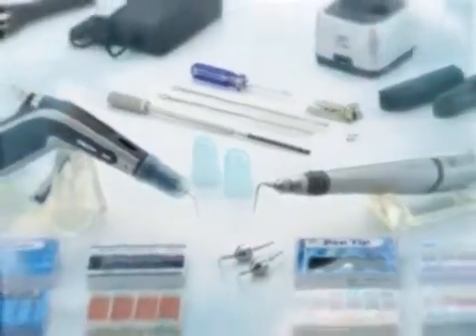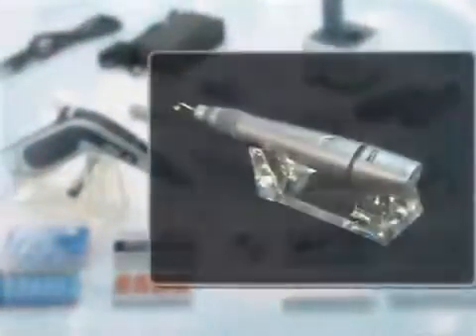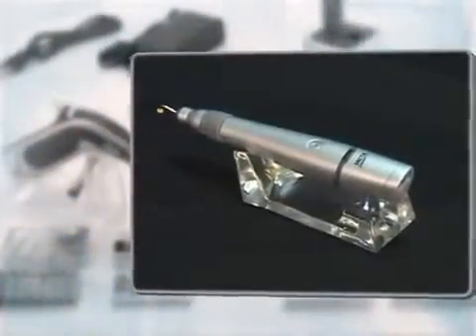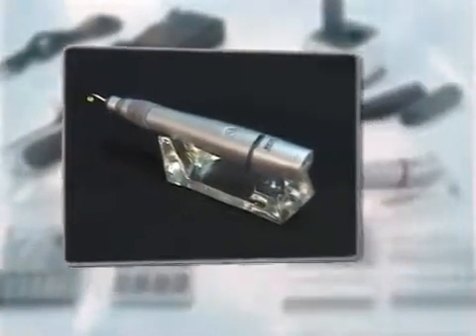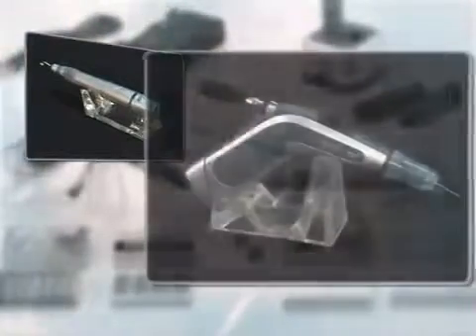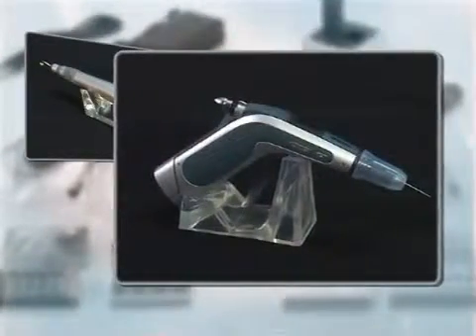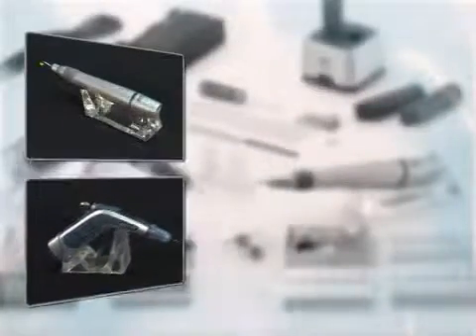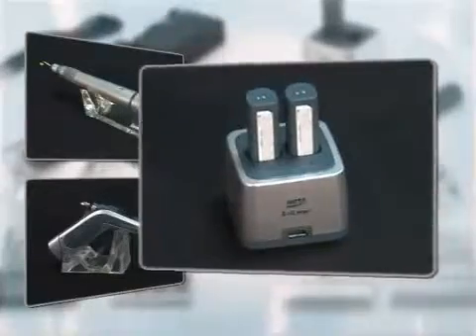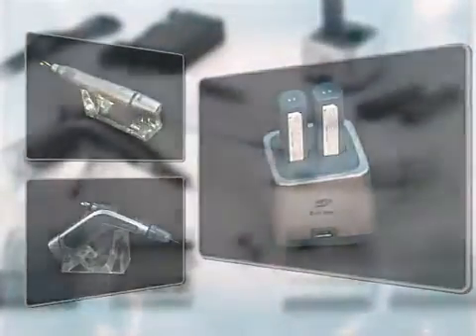These are the components of E&Q Master. The cordless pen features taper matching with Gutta-Percha cone, as well as quick heating and cooling. The clicker-type cordless gun allows you to insert softened Gutta-Percha into the root canal as much as needed. Also included are a charger which can charge two batteries at the same time, and other accessory tools.